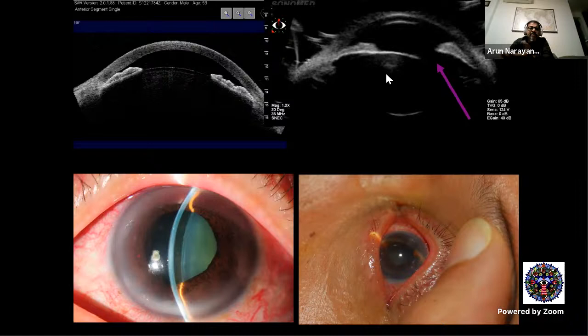So when you're given something to read, one ability is to differentiate whether the technology is the anterior segment OCT or the UBM, like you rightly pointed out. Look for these structures much better seen in these areas. And then, of course, look for other clues as to why there is a difference. Typically you assume nothing else is wrong, but here you have greater information in the form of lack of zonules and possibly a vitreous prolapse pushing the iris forward.